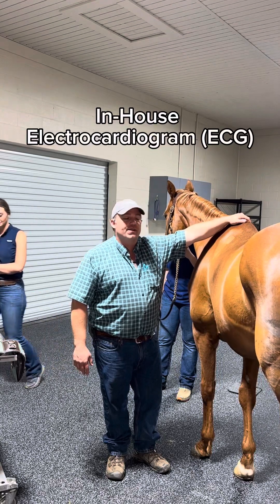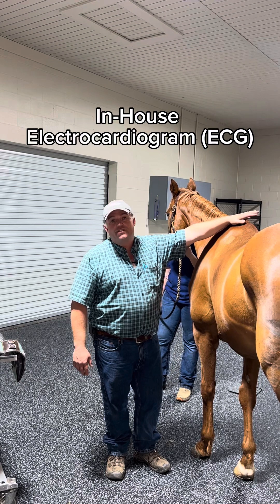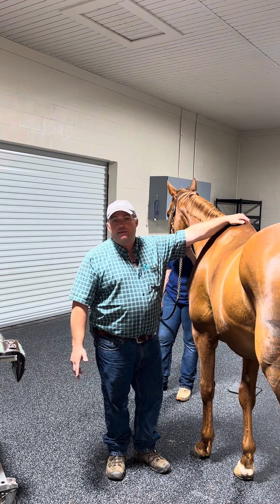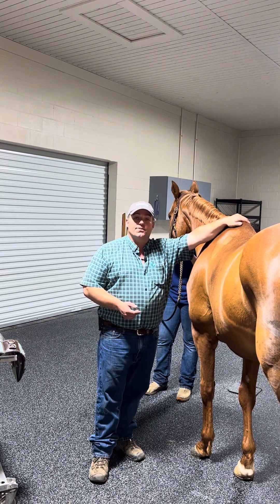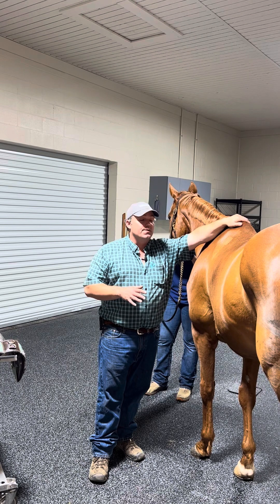Hey, this is Dan Carter with Countryside Equine Hospital here in Covington, Georgia. We have Fargo with us today. Fargo recently had a pre-purchase exam done and it was noted that we had an arrhythmia on pre-purchase. So to better characterize the arrhythmia, we're actually going to do a Holter monitor, which is a long-term monitoring device that allows us to record the ECG.